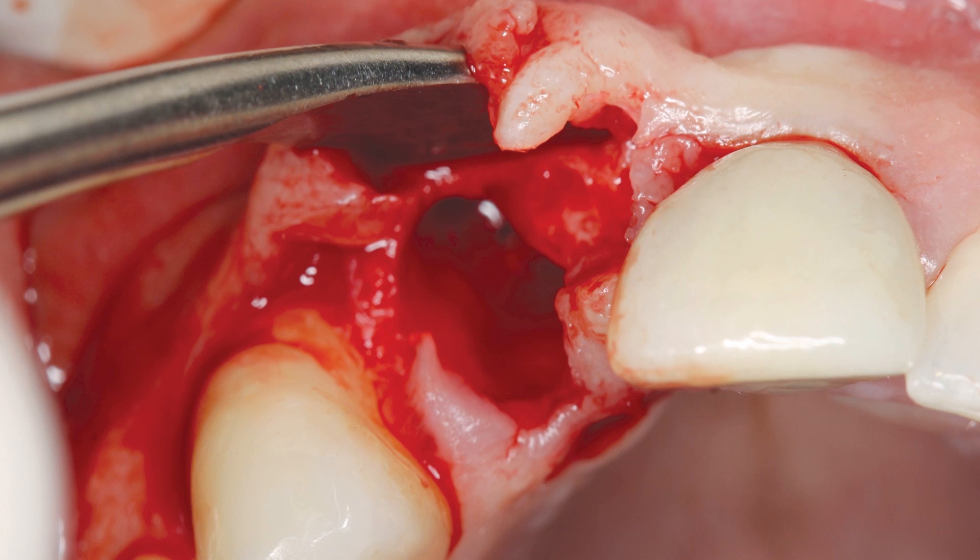Due to the aesthetic concerns involved with working in the anterior maxilla, an envelope flap was made, avoiding the creation of any vertical incisions. The envelope flap allowed visualization of the facial bone contours, evaluation of the interdental papilla, and observation of any dehiscence or defects in the facial bone. The facial wall had a slight defect that could be easily repaired and there was adequate bone apically to stabilize the implant.